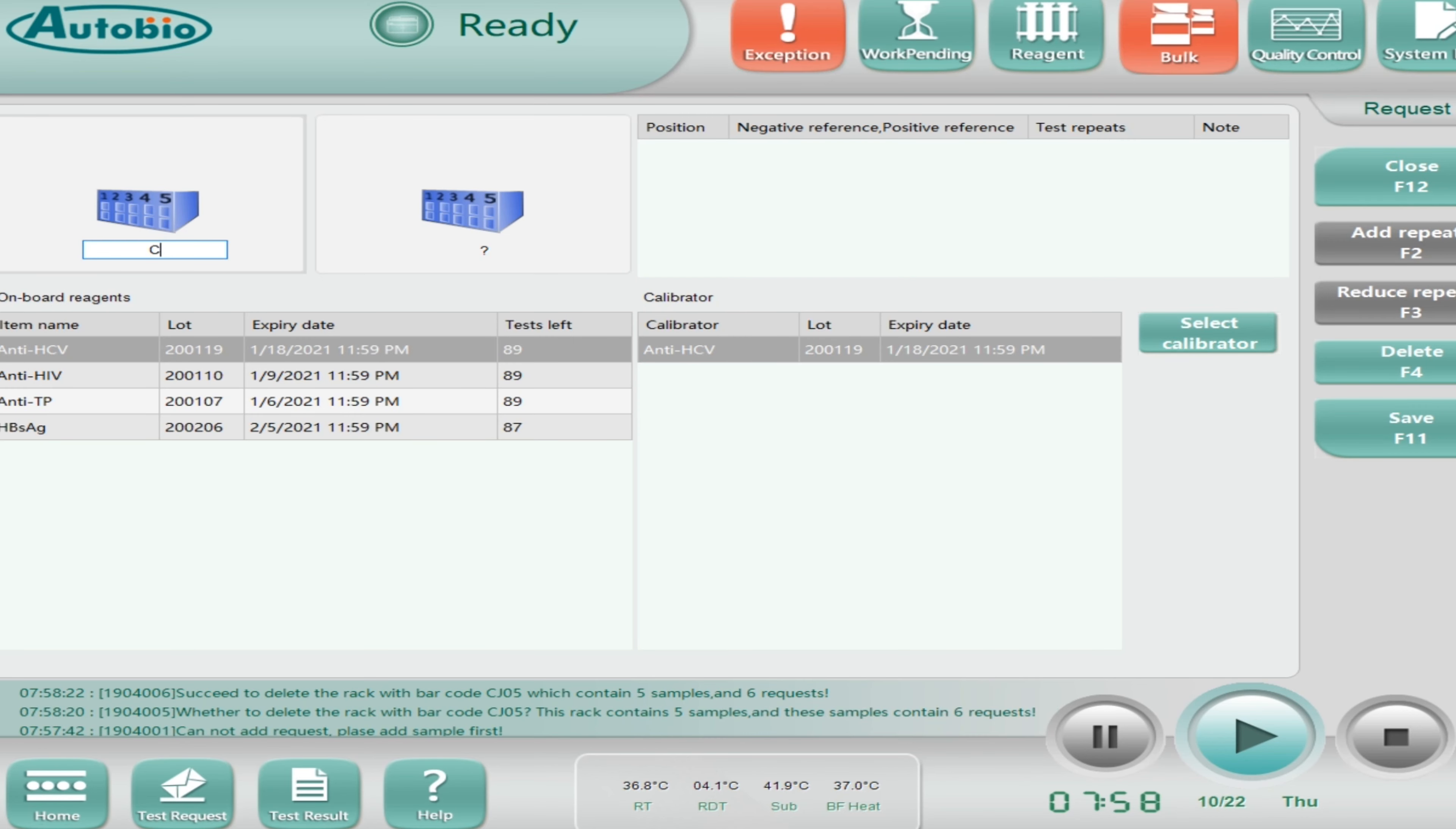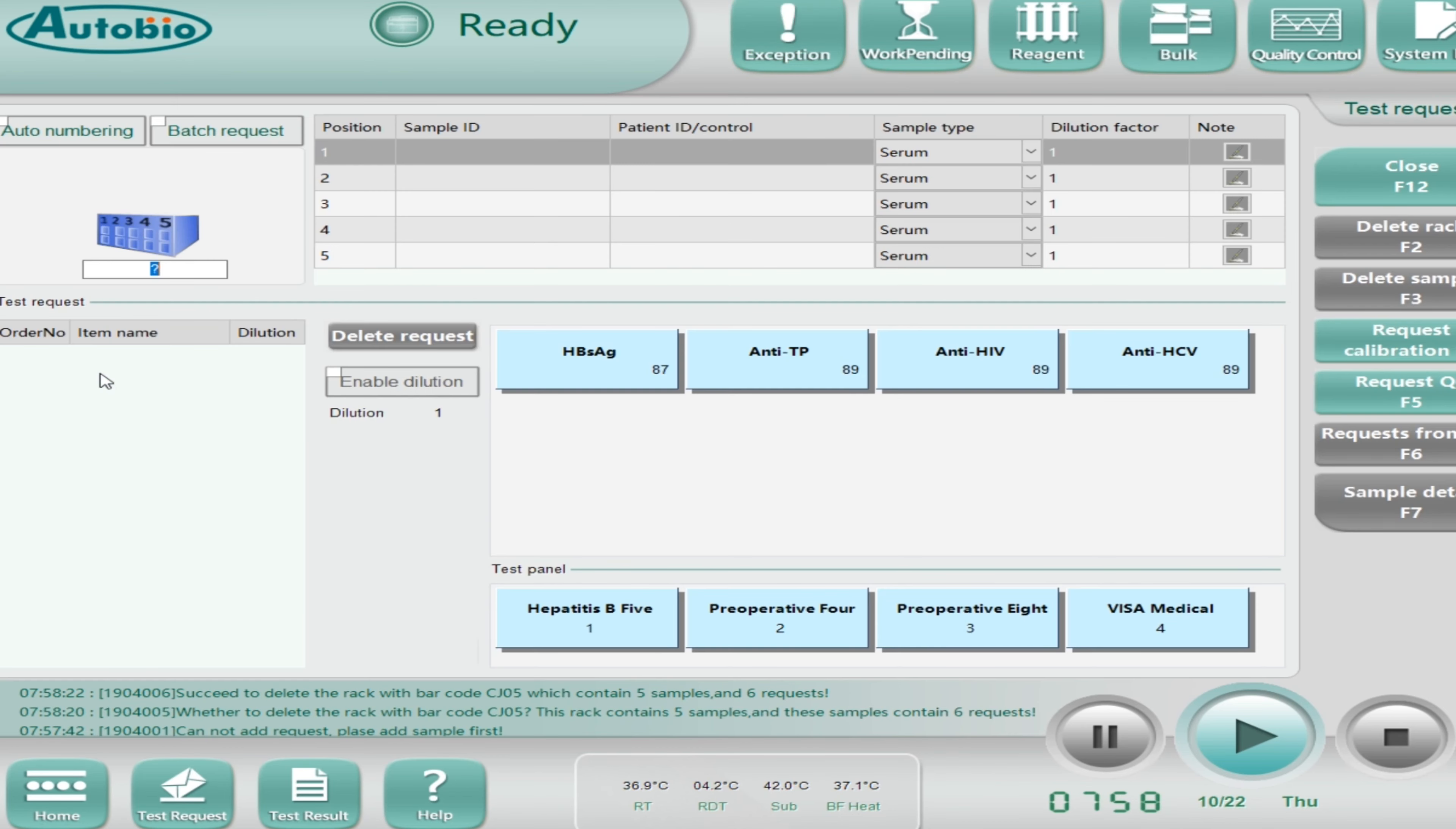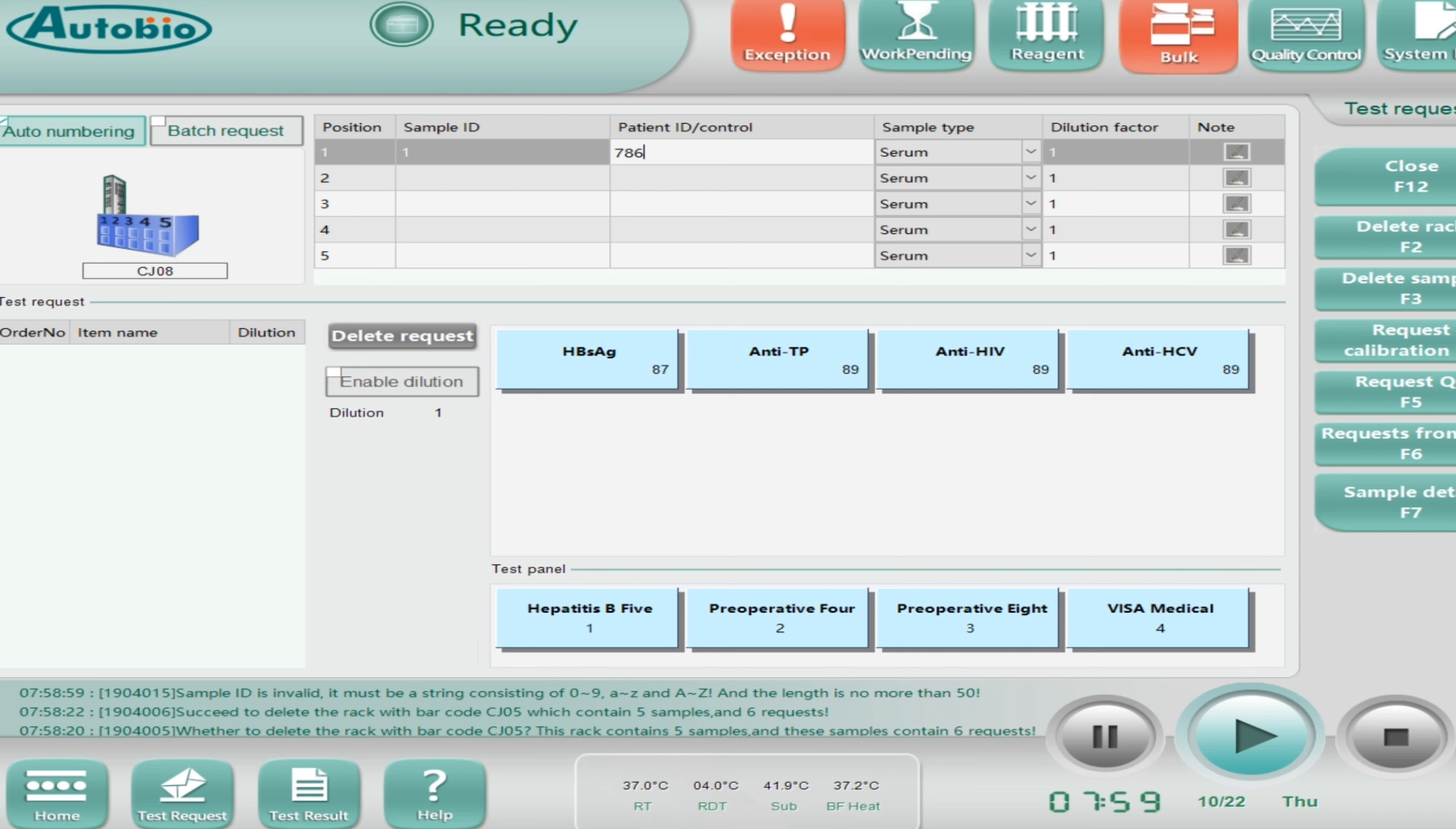For the third position, select, for example I want to run the HTP, I'll enter any ID, click on the reagent, and same as for the next position. This is the way how to run the quality control. Finally click on the play button to start running the QC like this. Now if you want to delete, click on delete rack, click OK, and then again OK. In this way you can delete the rack if you don't want to run.